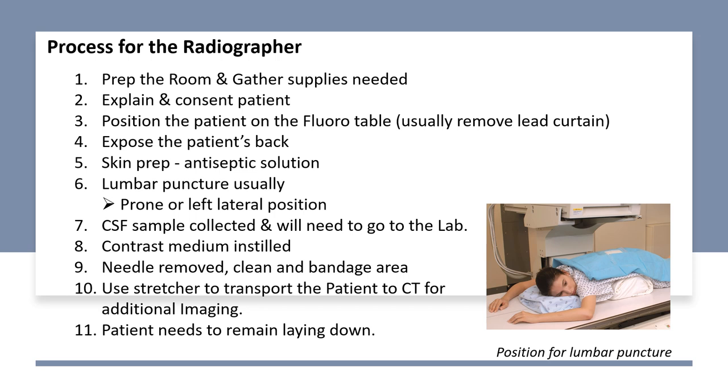You'll use the stretcher to transport the patient to CT for additional imaging, and then the patient needs to remain laying down for the rest of the afternoon and the evening and take it easy.